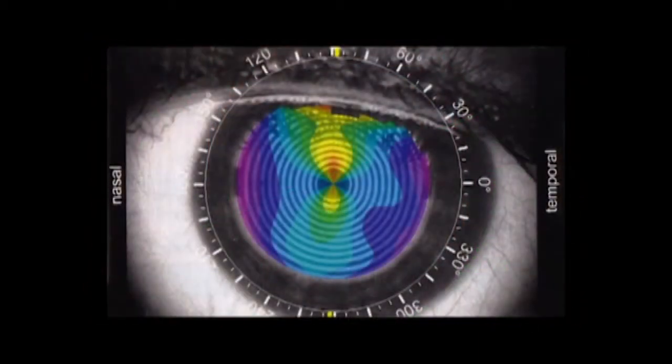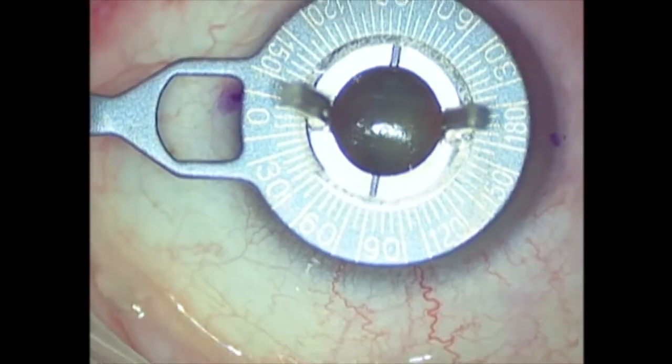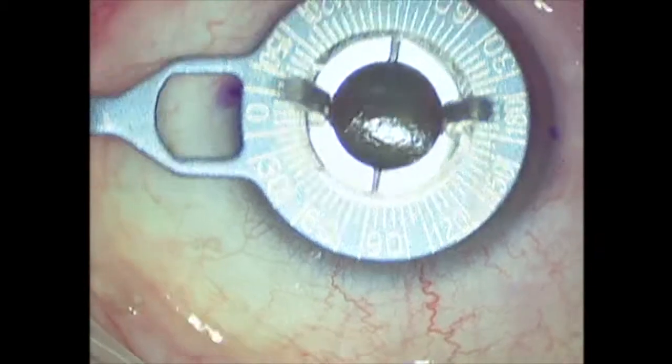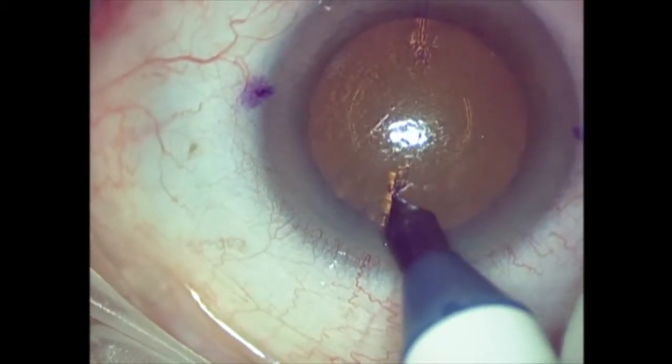Regarding the IOL power, there is a tendency to target toward a myopic outcome, or they will end up hyperopic. These patients have an altered Gullstrand ratio, so there is a need to put in a higher power IOL than you planned for. The amount of fudging is based on the amount of steepening they have. The power of the toric would be determined by the case.